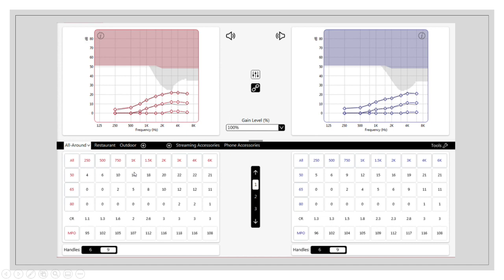So the gain set for low level sound in this band is 14 dB. When I receive a moderate or mild level sound, I amplify it by 5 dB. And when I receive a loud sound, I'm not going to amplify at all, so it is mentioned as 0. Likewise, we have gain values across frequencies.